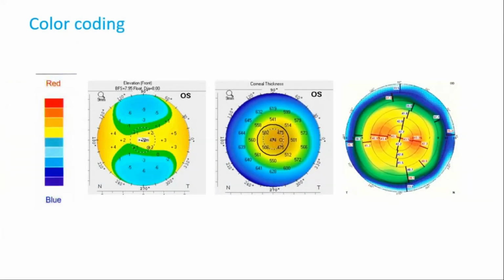Yeah. Stop here. So on this, if you look at the extreme right, I don't know if you told that, maybe I missed it. In the extreme periphery, can you see those black dotted areas? Yes, sir. What does that signify? That indicates there is inadequate exposure and we need to repeat the scan again. No, not necessarily repeated, because these are extremely in the periphery. So you don't really need to repeat, because the dotted area represents those areas where the machine could not capture.